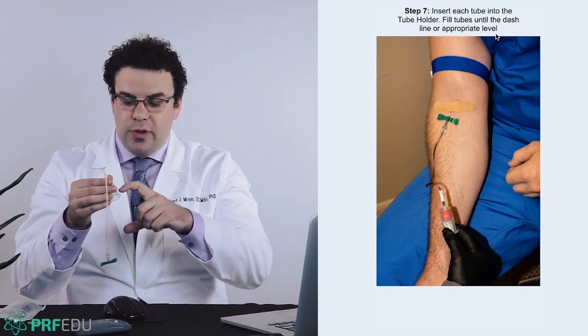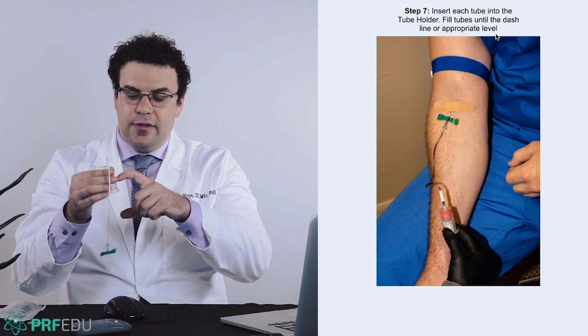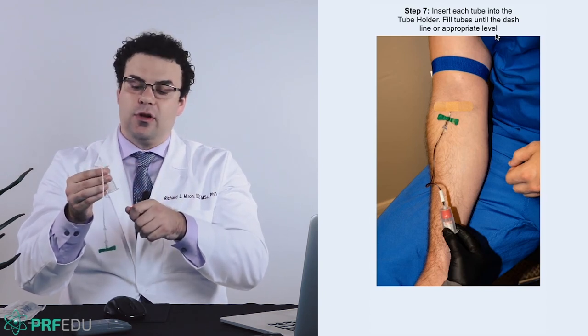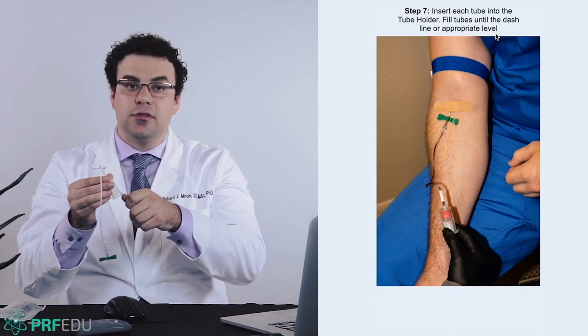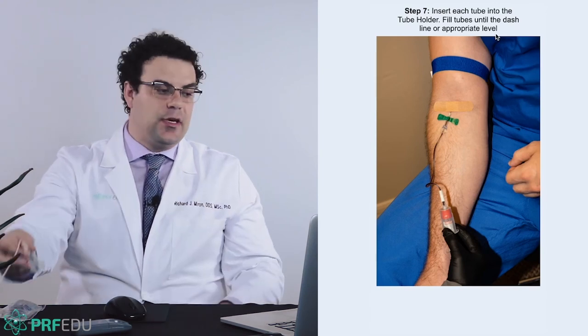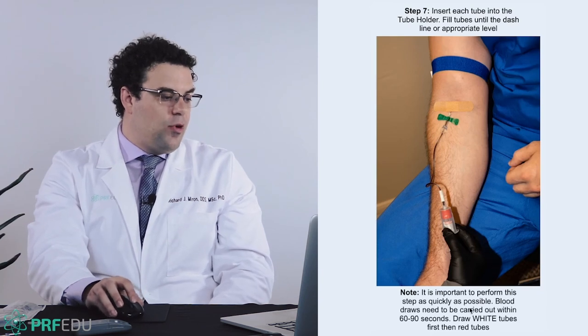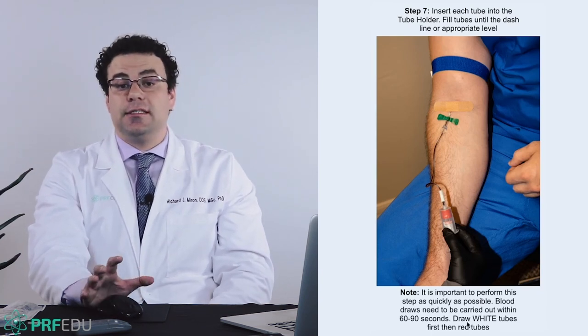And sometimes if you go in too slow, remember that the needle that's passing in here, you might lose a little bit of vacuum. And sometimes you see people that work a little bit slower where they go in slowly, you hear a little bit of the vacuum that's being lost. So enter in there quickly, okay? And remember always that you got to do this within 60 to 90 seconds.